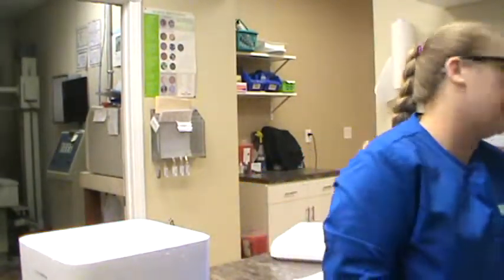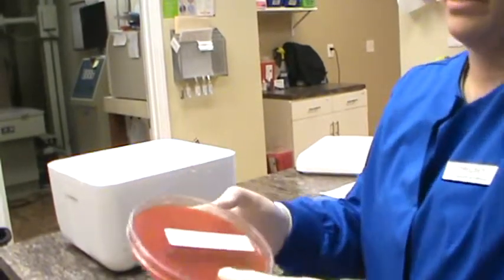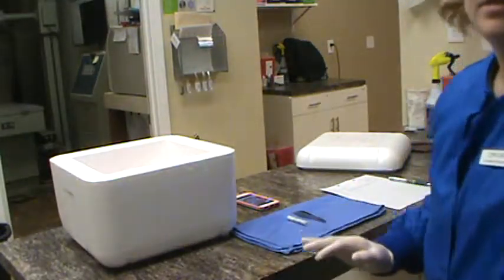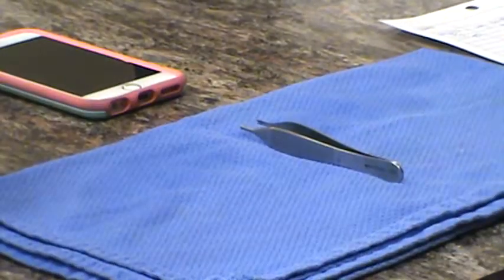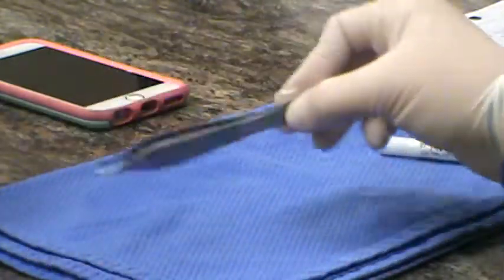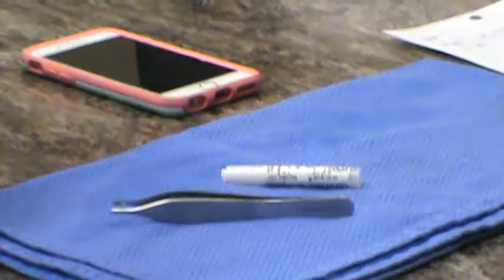Hello, this is Chelsea Marks back with VETT 222, task 18, which is a culture and sensitivity. We have our supplies here: the homemade incubator, and our patient plate, clearly labeled. We have some more supplies over here that I'm going to zoom in on, which are our antibiotic discs. See if you can see those better. There they are. Little antibiotic discs, and little thumb forceps to put those discs on the plate with. And I have my iPhone here with some pictures of some bacteria.